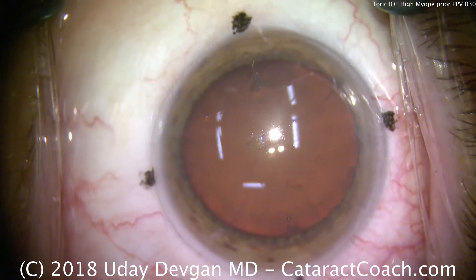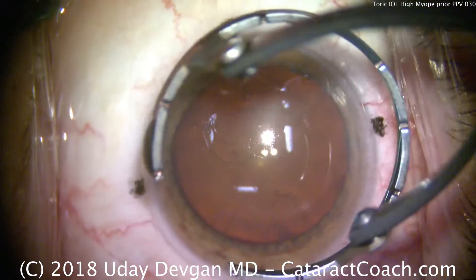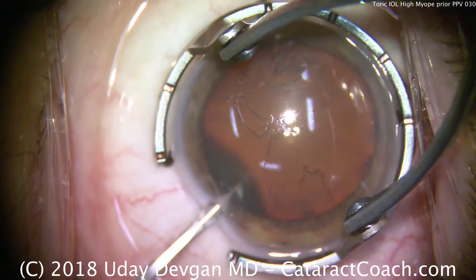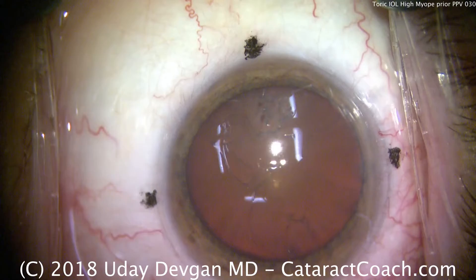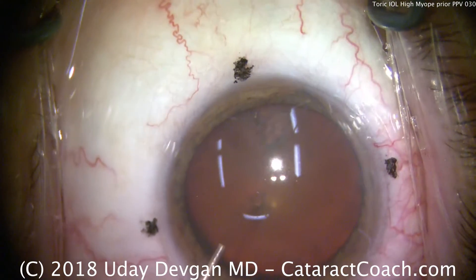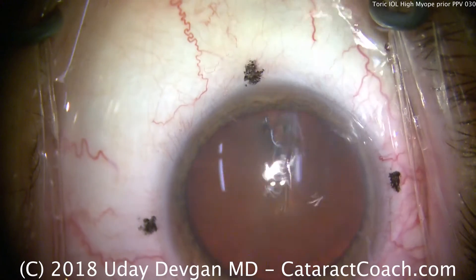These puncture marks stay very well. They don't wash off or bleed like ink marks may, and they're also unobtrusive. It's simple enough to then line up the three dots of the Torque lens with the three dots that are made on the cornea.